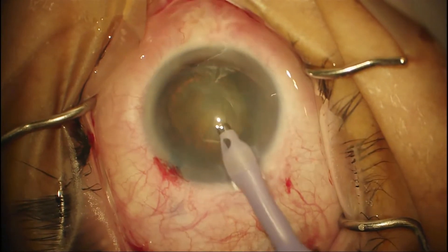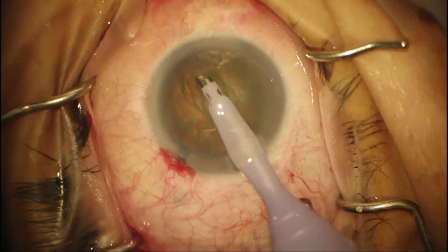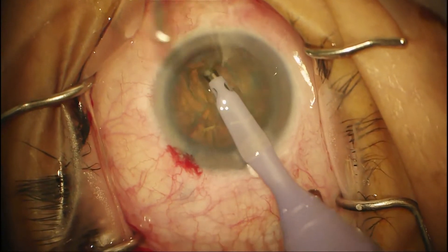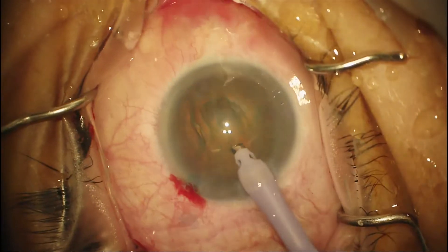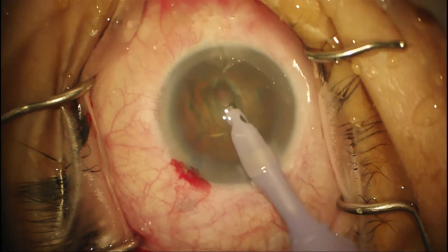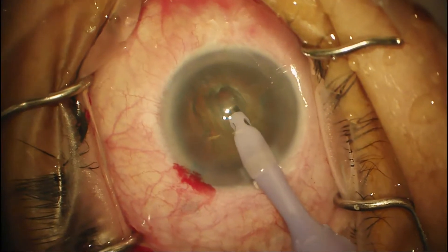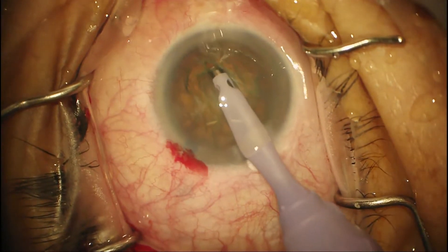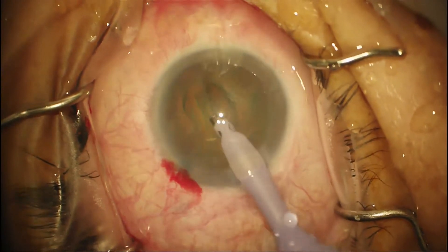Once it's in the eye, I rotate it 180 degrees. So I use continuous irrigation, enter the AC, rotate 180 degrees, and then begin the divide and conquer technique by creating a central groove. What you should see is cutting with minimal moving or distortion of the wound or moving of the nucleus. How wide should that central groove be? About one and a half to two phaco tips would be reasonable.